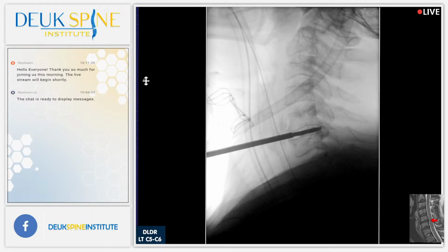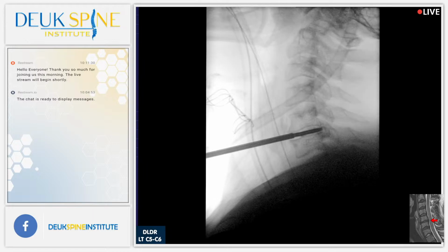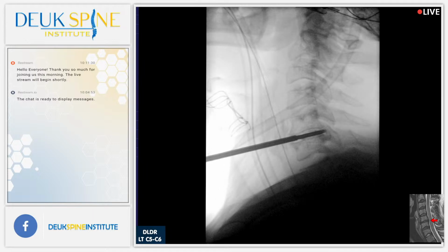And we're just doing little taps, and my team is pulling, and I feel that it's actually helping. He's got a lot of scar tissue in the disc, actually, more than I expected before. Are you guys giving me inline? Yep. Okay, I think it got a little blurry. All right, so I'm going to have to pull the dilator back a little bit.